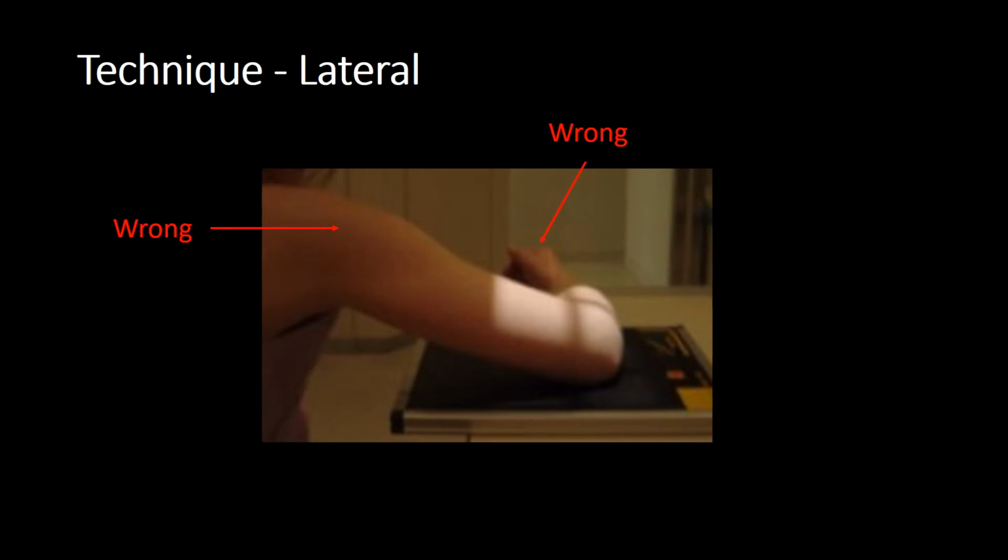The other really common mistake we are taught with an elbow view is to rotate the hand so that it is in the lateral view, thereby causing the radial head to be rotated clear from the proximal ulna. The problem with this is that the most common injury, as already mentioned in adults, is a fracture to the radial head or neck. If we think back to our anatomy, the proximal radioulnar joint and the distal radioulnar joint are pivot joints, and so if you're asking your patient to pivot the hand to the lateral view, this will hurt the patient.